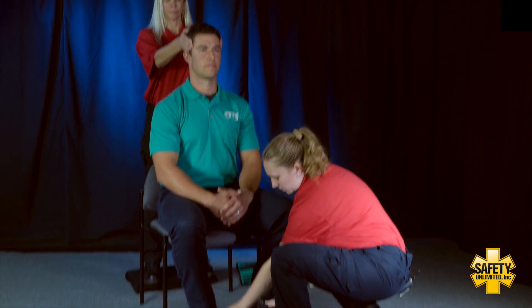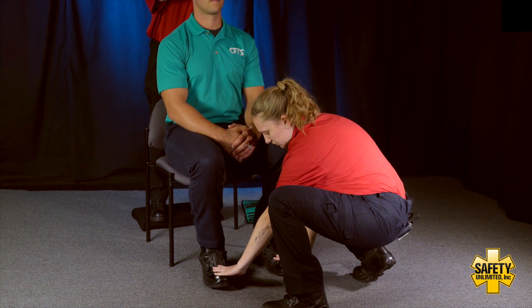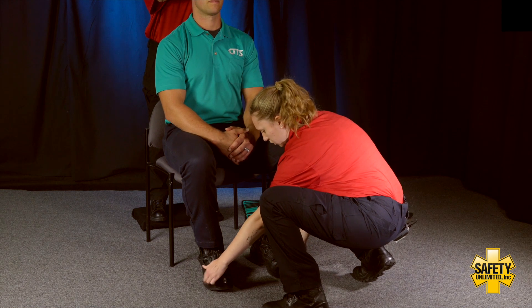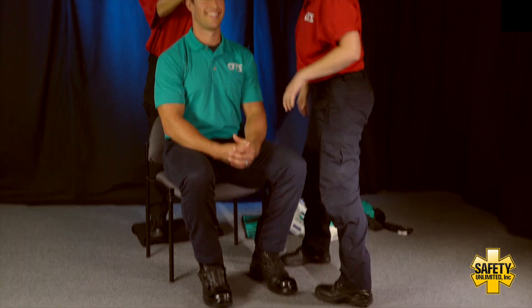Now for the lower extremities, checking bilateral pulses — present and equal bilaterally. Can you go ahead and push up on my hands for me? Can you tell me which toe I'm touching? Big toe. And which toe I'm touching? Big toe, also.